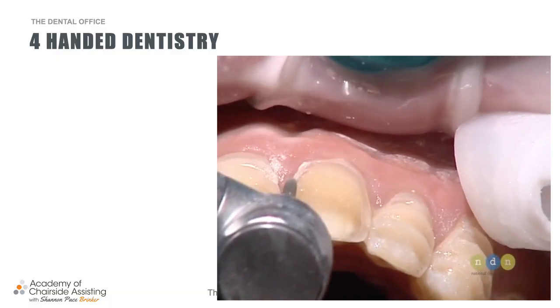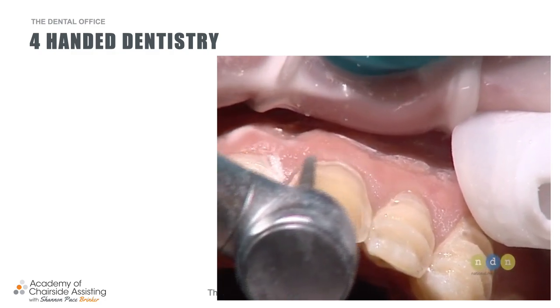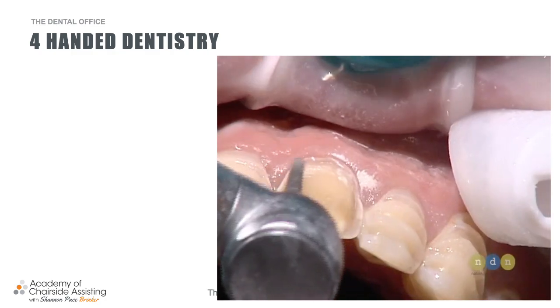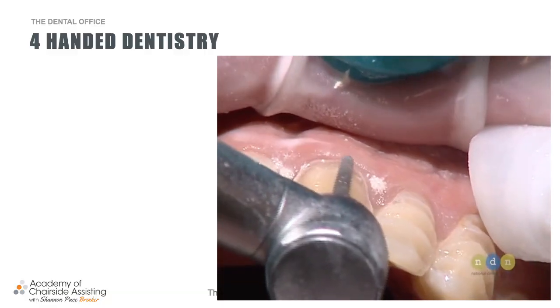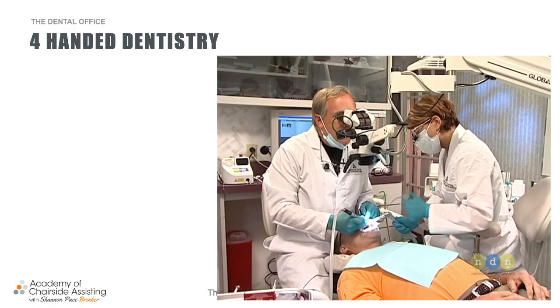And the one thing that I will tell you is, when we get into our bleaching module, I don't like to use this for in-office bleaching. Some people like to utilize it for that, but I don't think it's safe. And I really only want to utilize this for direct and indirect procedures.